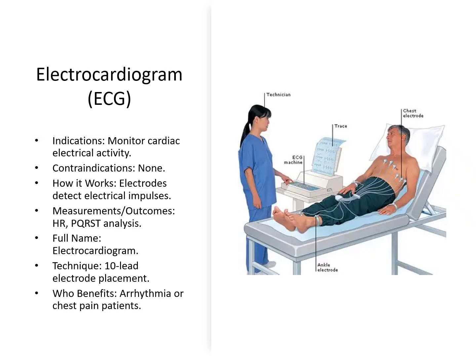An ECG is used to monitor cardiac electrical activity. There are no major contraindications. It works by detecting electrical impulses through electrodes. Outcomes include heart rate and PQRST waveform analysis.